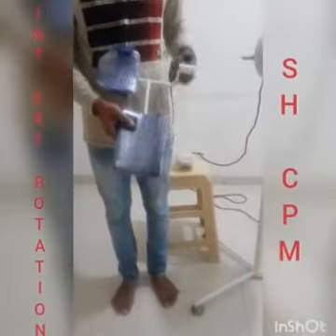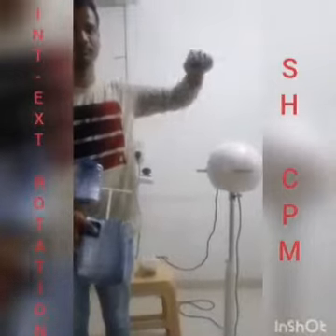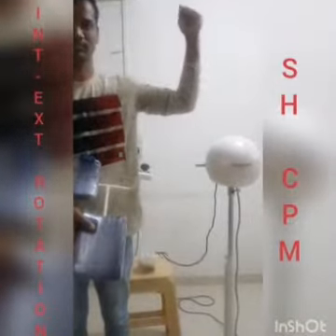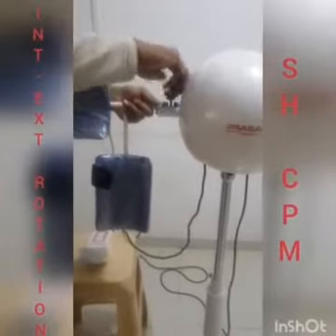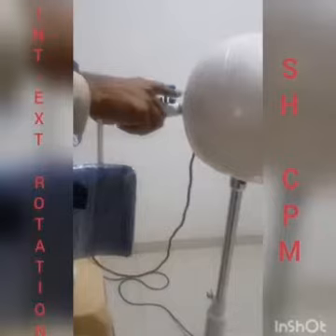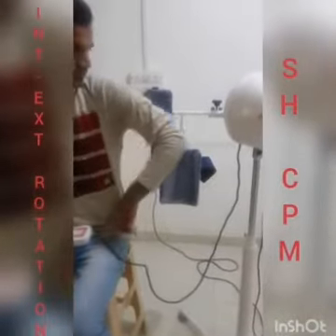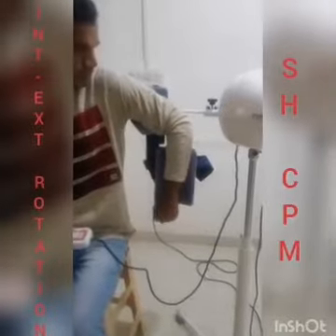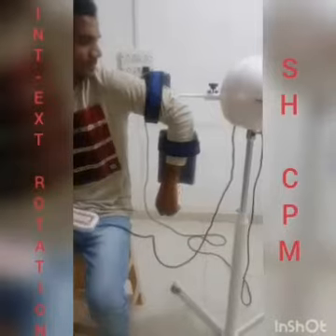Use this splint for the movement of internal and external rotation. Connect the splint to the machine head in this way and tighten the screws. Now, place the patient's hand in this way and tighten the belts.